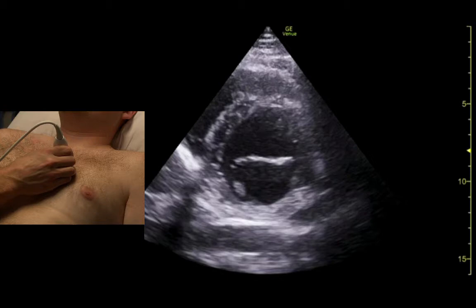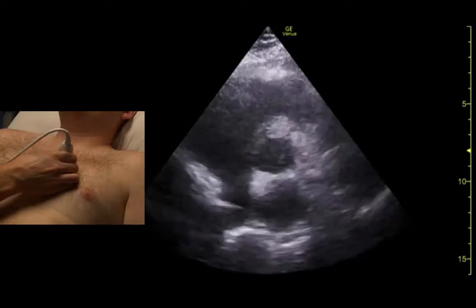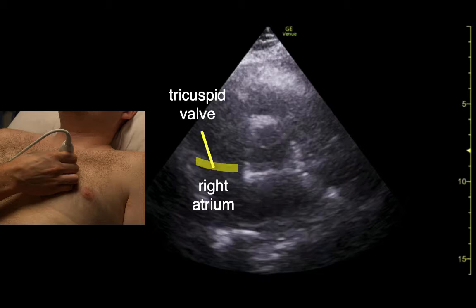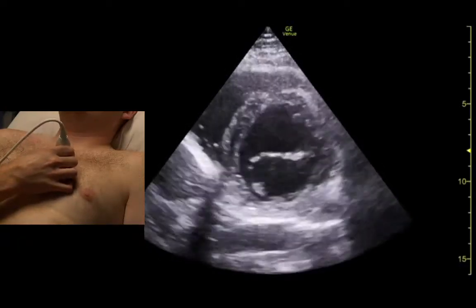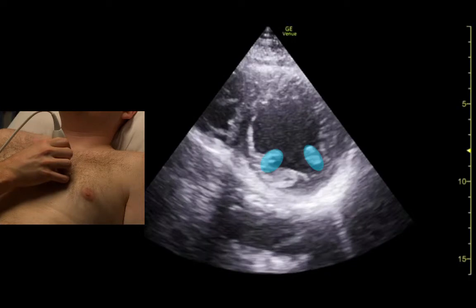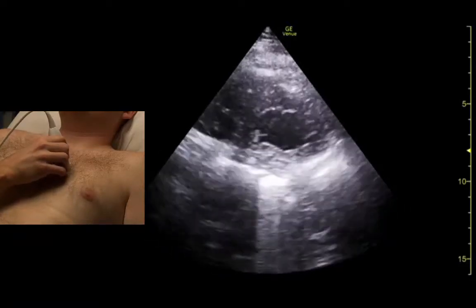We can fan in towards the sternum to get a view of the aortic valve in cross section. As we fan away, we get the mitral valve in cross section — it's the fish mouth view. A little further out is the mid ventricle where we see the papillary muscles, and we may go out even further to see the ventricular apex.